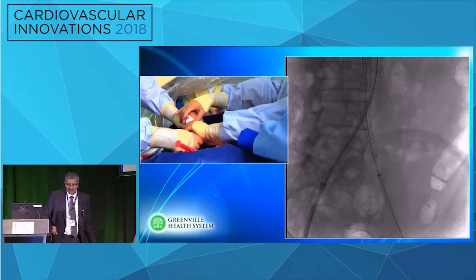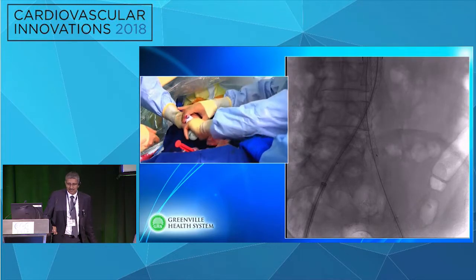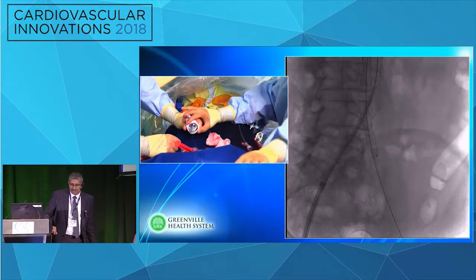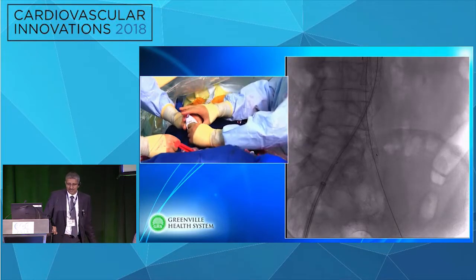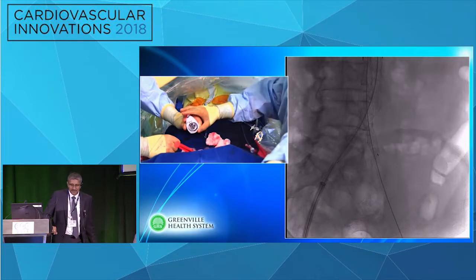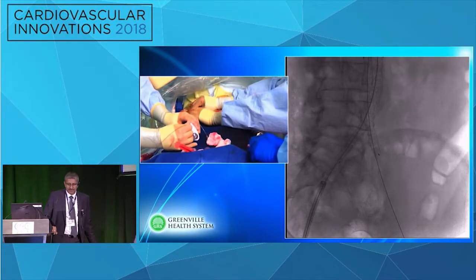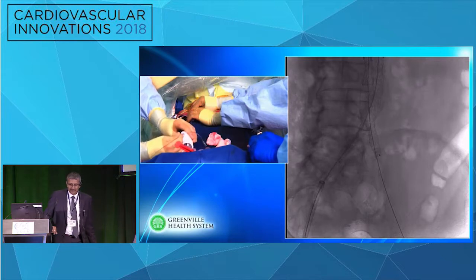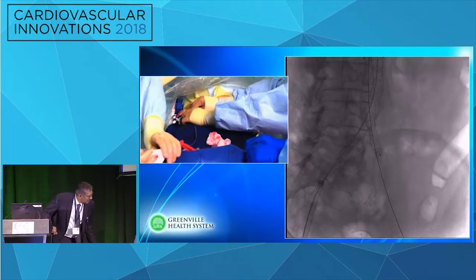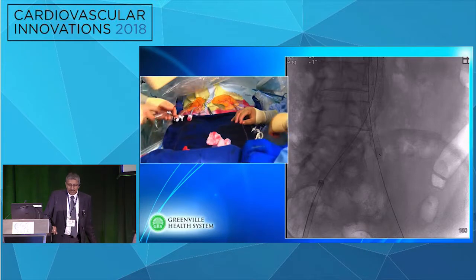So then we're going to make sure that this is completely deployed there, or unconstrained. We lose constrainability here. You don't see anything there. And the last one twists off, and our iliac limb deploys. Okay, so now I'll hold the sheath. Come off with the device. Beautiful. All right, I've got your wire. Okay, go ahead and flush your sheath. Keep coming, walk it off.